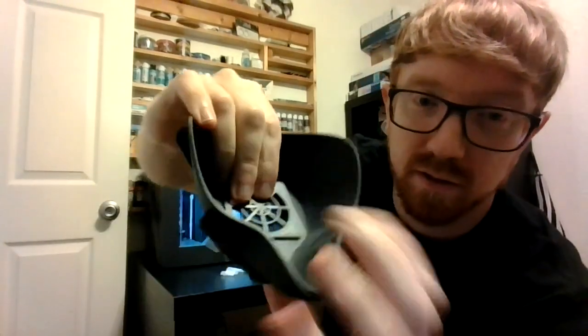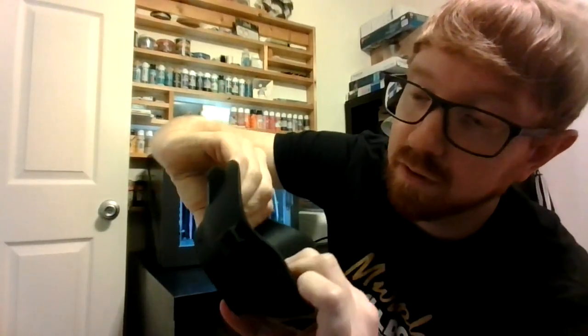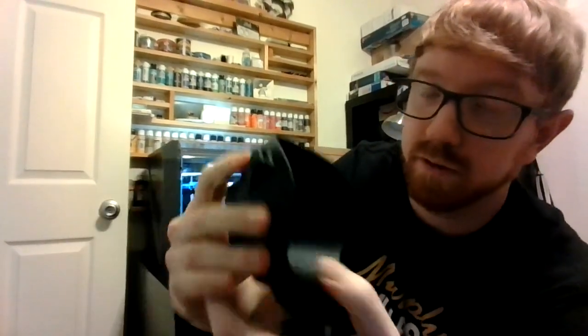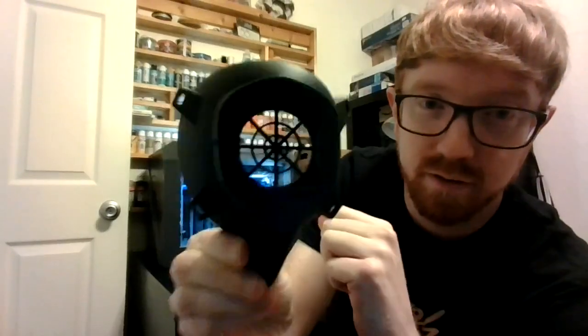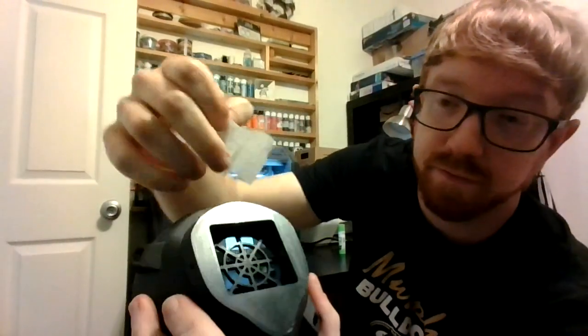So the first thing I want to do is put this piece inside here — and it snaps in. There we go, it's in there nice and secure, won't fall out. Now I'm going to put my filter in. It's got a nice little square area for the filter. Double that up and push it down in there.